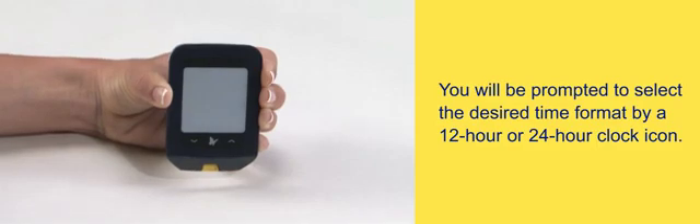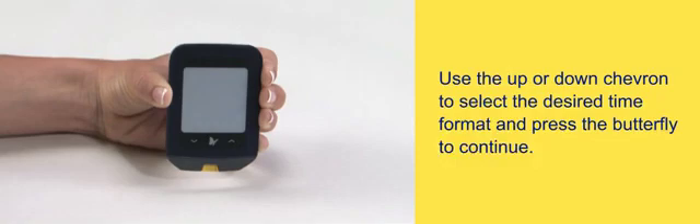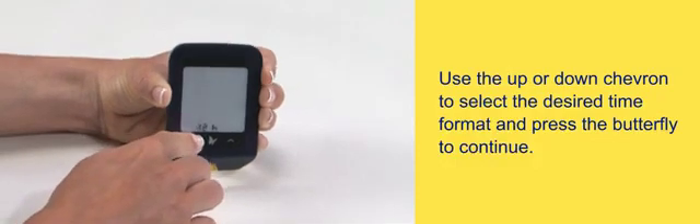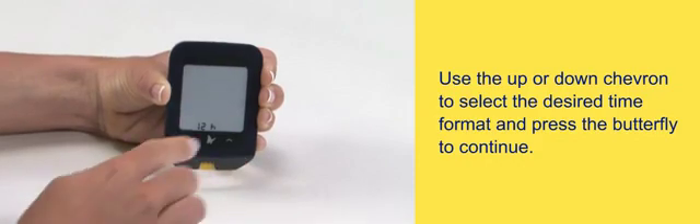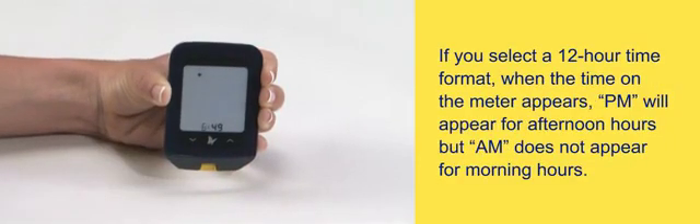Select a 12-hour or 24-hour clock icon. Use the up or down chevron to select the desired time format and press the butterfly to continue.